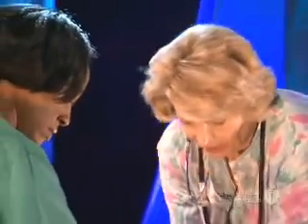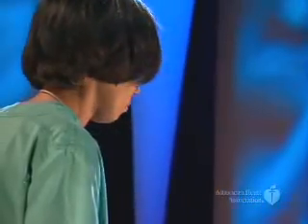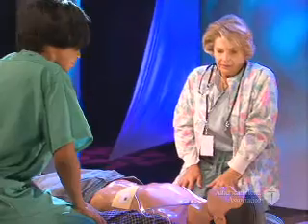Analyzing heart rhythm. Say clear. If the AED finds a heart rhythm that could be treated with a shock, the AED will tell you so. Shock advised. Stay clear of patient. Deliver shock now. The AED will then tell you when to push the shock button.